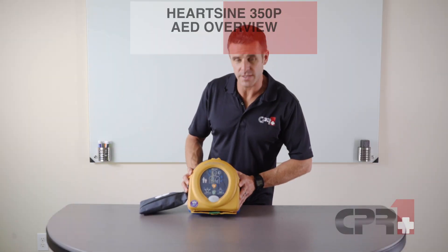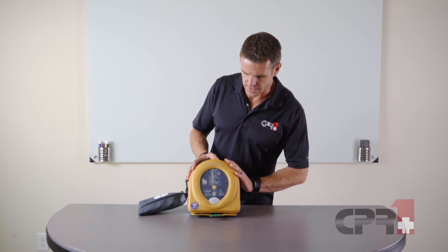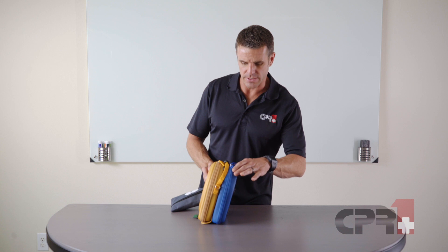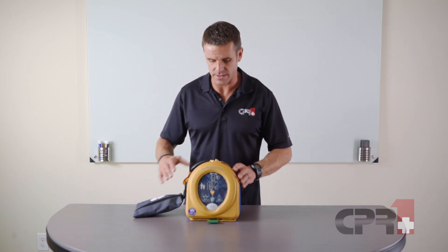This is an overview of the HeartSign 350P AED. As you can see, we've got this one here in the protective case, which has a back case here for extra supplies, and it has a first responder kit attached as well.